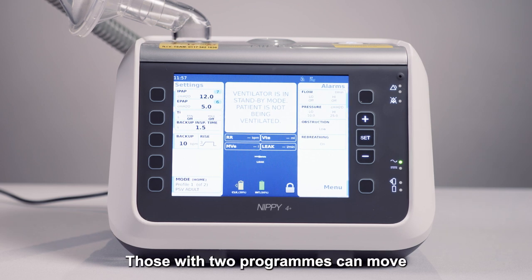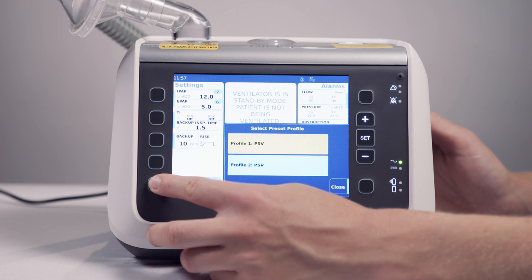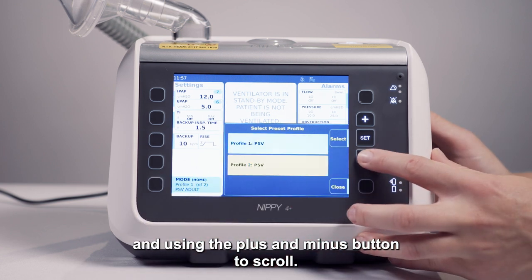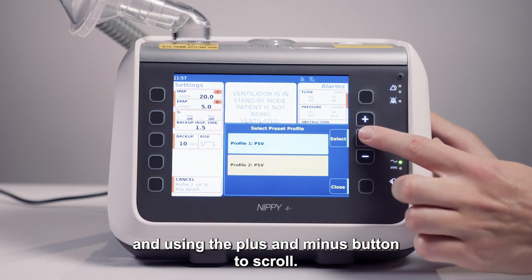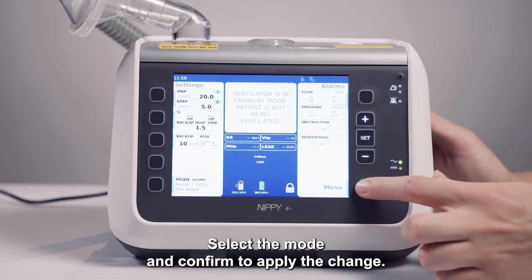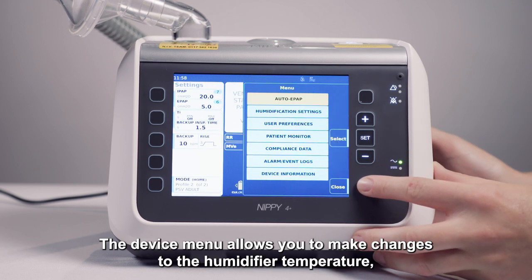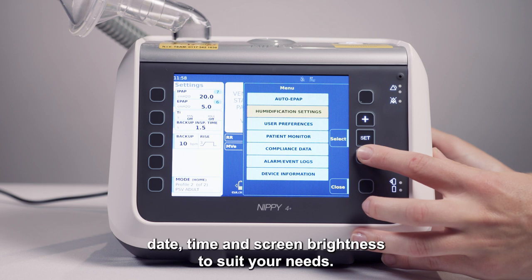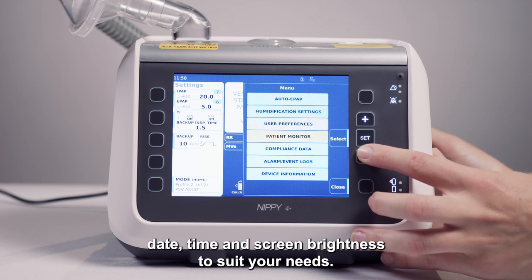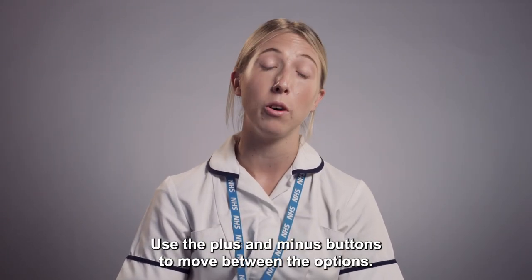Those with two programs can move between them by pressing the mode button and using the plus and minus buttons to scroll. Select the mode and confirm to apply the change. The device menu allows you to make changes to the humidifier temperature, date, time and screen brightness to suit your needs. Use the plus and minus buttons to move between the options. You may be asked to access the alarm log to help the team fix any problems with the ventilator.